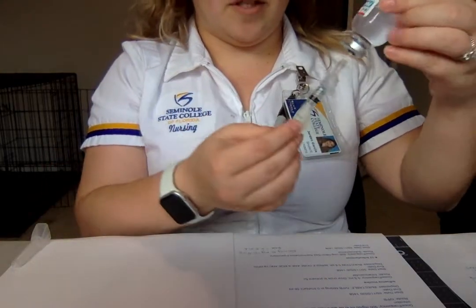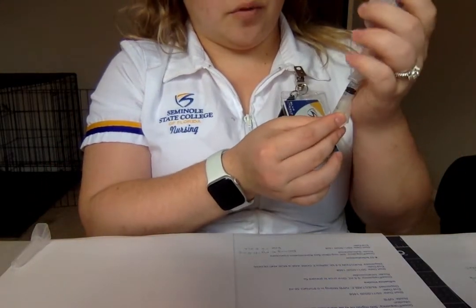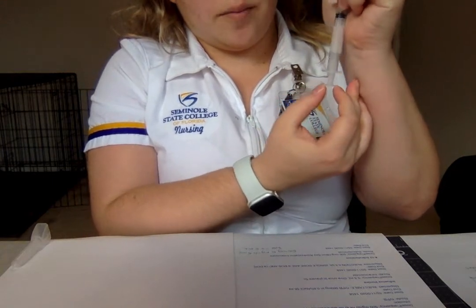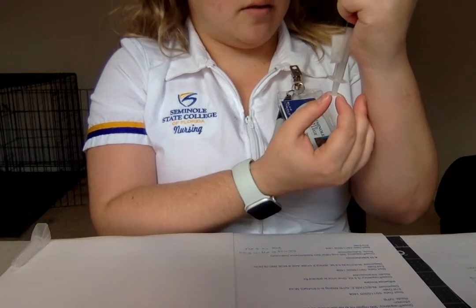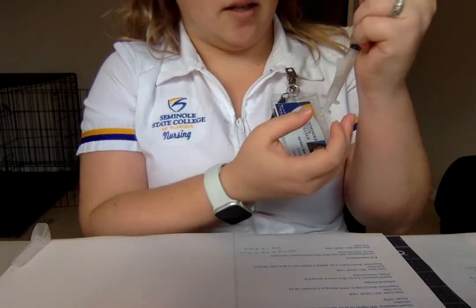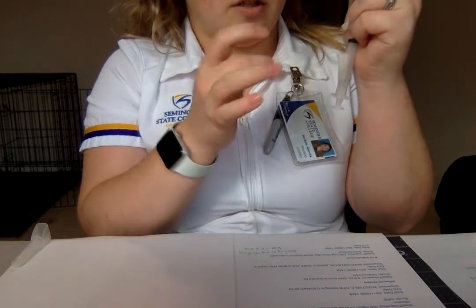I'm going to flip it and pull back 0.5 mLs of the medication. Again, not touching the plunger so I don't contaminate. And as I'm pulling back, if I get any air bubbles in the syringe, I'm going to just flick it gently to tap the air out.